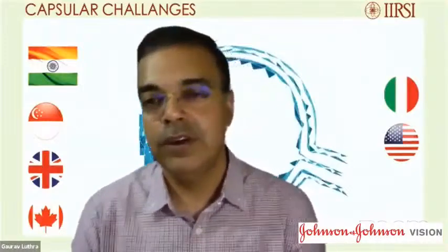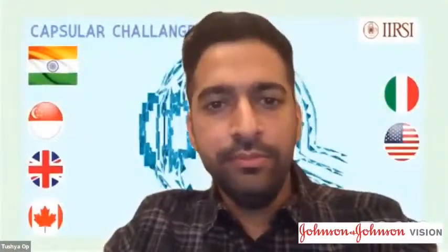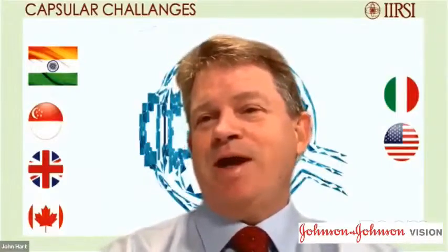Thanks, Dr. Aviser. I'll take John here and ask him, Tushya showed very nicely how to convert the pre-existing break into a continuous rexis. How often would you be able to do that in a posterior polar cataract with a break in the posterior capsule? Is it easy or difficult, and some pearls on that, John? When I do a posterior polar cataract, for the most part, I leave the posterior capsule alone. I think that's something that I will deal with by YAG capsulotomy later, for the most part.